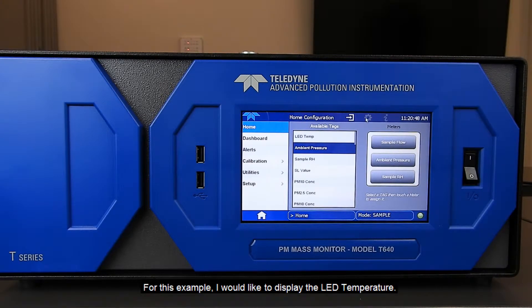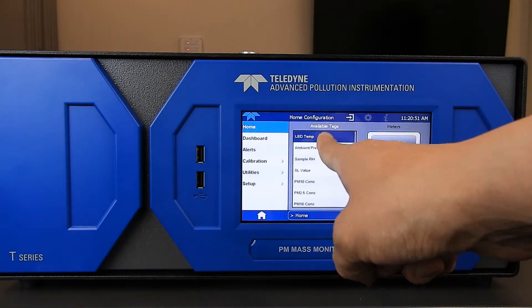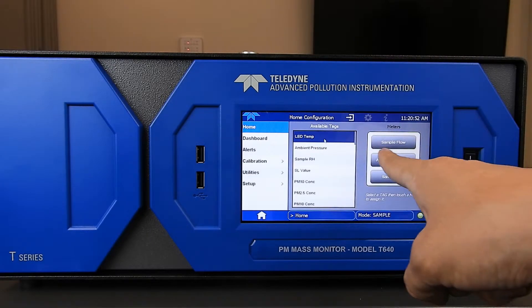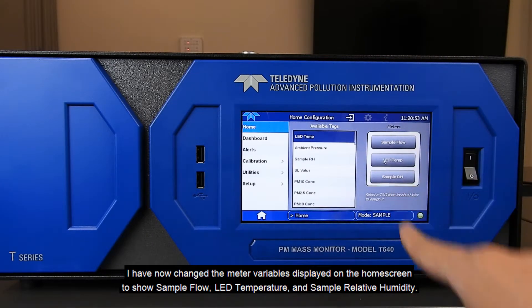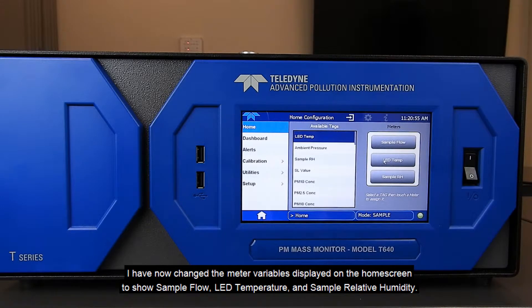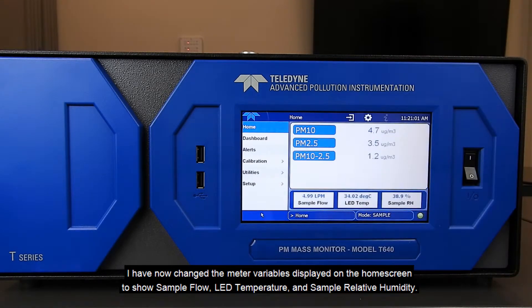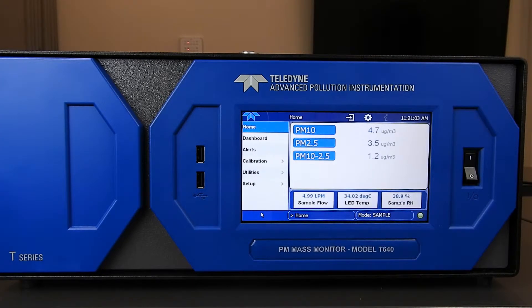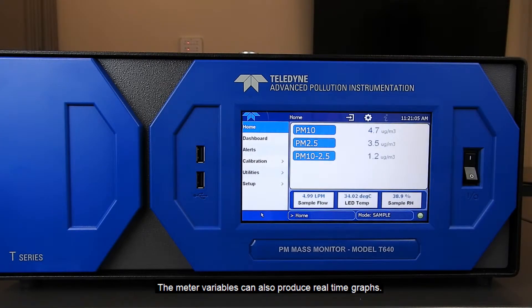For this example, I'd like to display the LED temperature. I have now changed the meter variables displayed on the home screen to show total flow, LED temperature, and sample relative humidity. The meter variables can also produce real-time graphs.